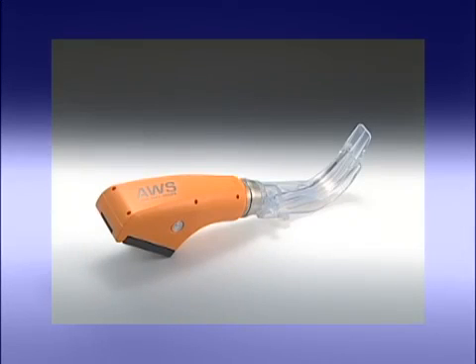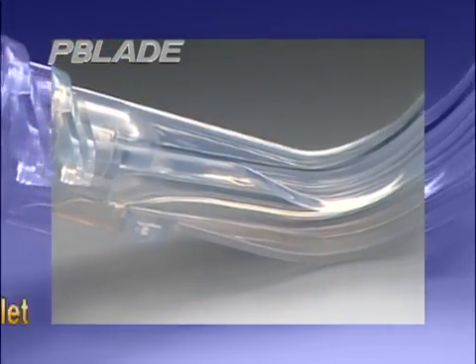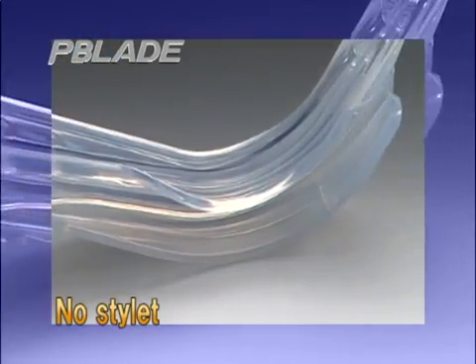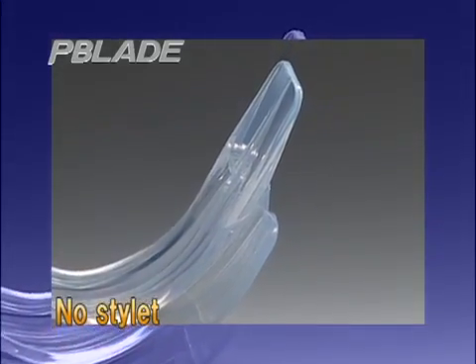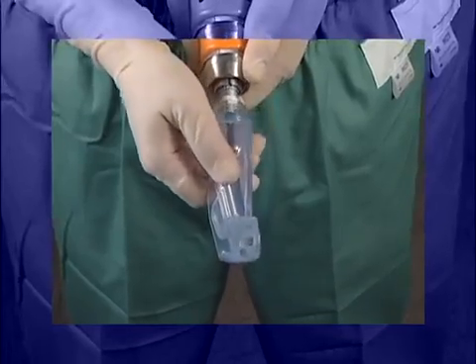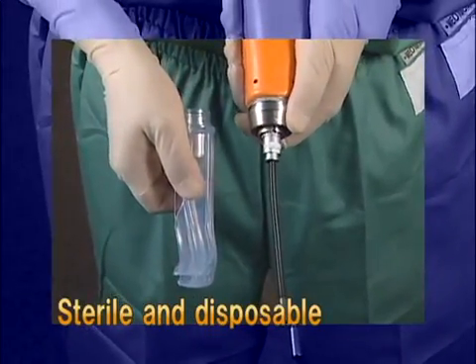No stylet is needed. The P-blade of the Pentax AWS is a laryngoscopic blade and has a guiding groove for endotracheal tubes, making intubation safe and more reliable. The detachable P-blade is sterile and disposable, eliminating the risk of infection.